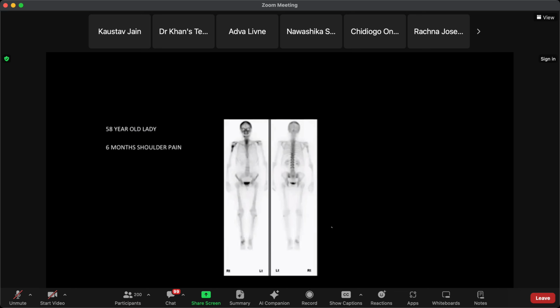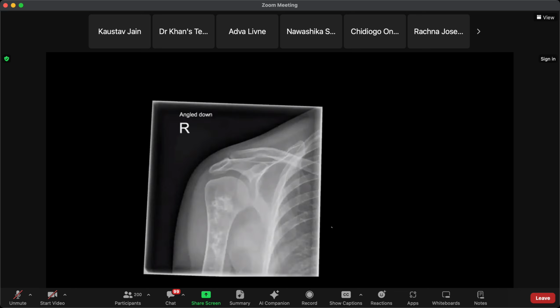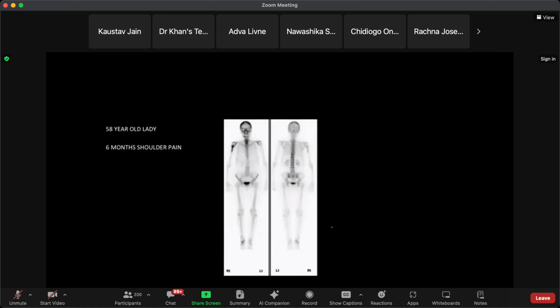Not entirely. I'd have to look at CT and correlate with the other images. Just looking at the X-ray alone, and that there are no other areas of abnormal uptake and I can see the renal shadows, does not always mean there's no malignancy.